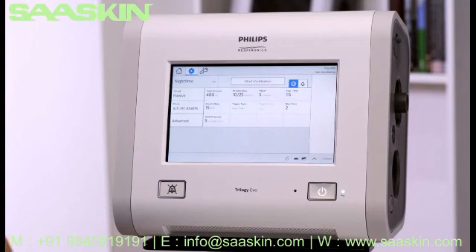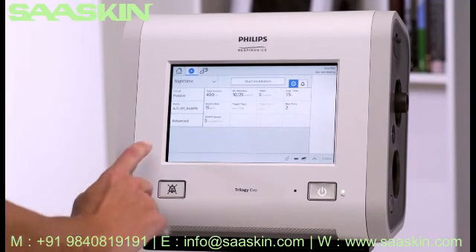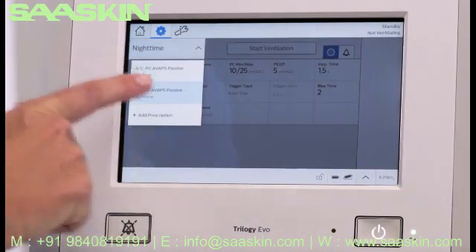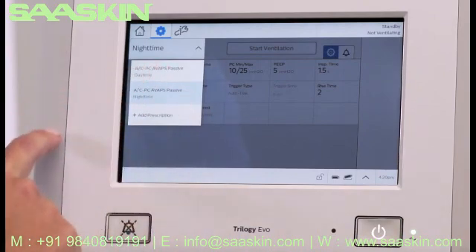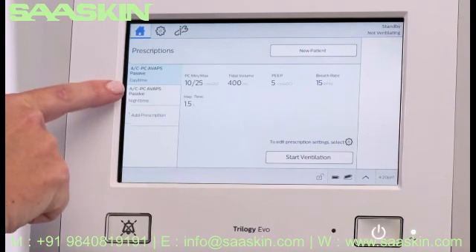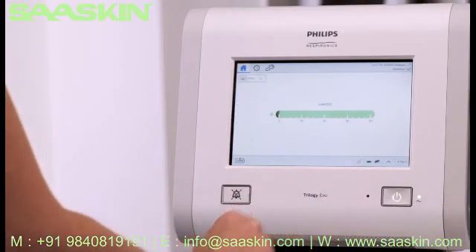You then have two options to start therapy. While still in Settings, you can select the desired prescription from the drop-down menu and tap Start Ventilation. Alternatively, you can go to the Home window and select the desired prescription on the left-hand side and then tap Start Ventilation.